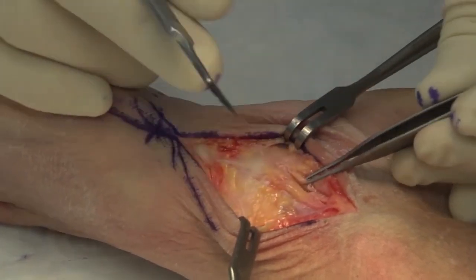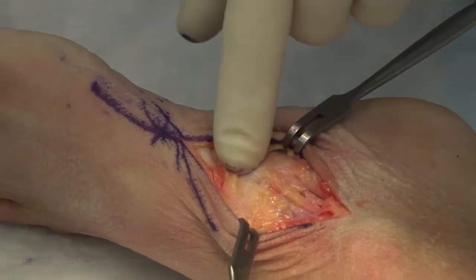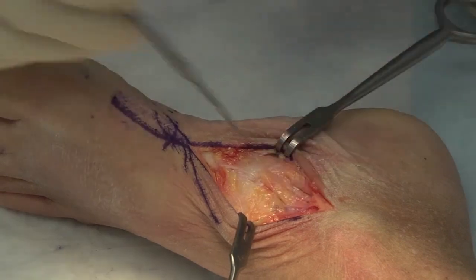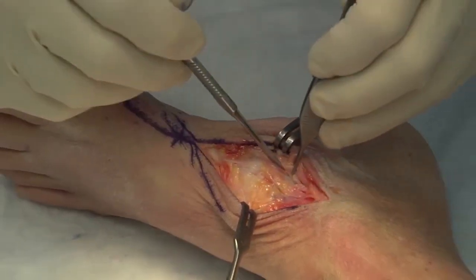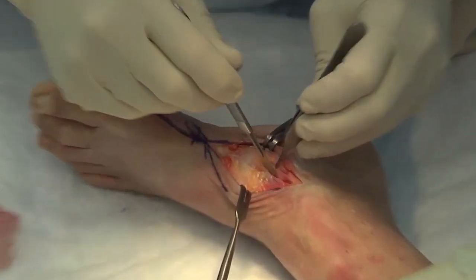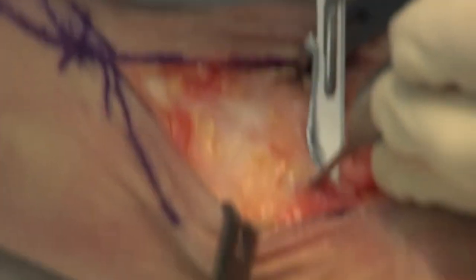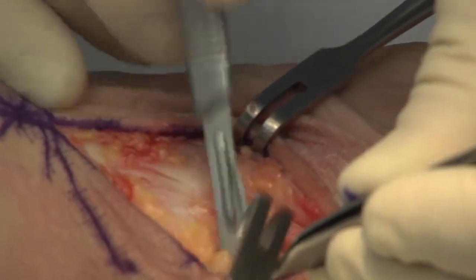If it's a flat foot with a torn, degenerative, painful posterior tibial tendon and we're doing a triple arthrodesis or a modified triple arthrodesis involving a talonavicular fusion, you can come down and excise that posterior tibial tendon and eliminate that pain generator. Now we will do a longitudinal incision and just raise an envelope of soft tissue to expose the talonavicular joint.